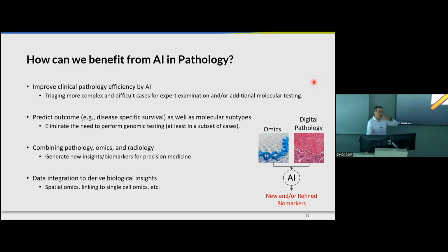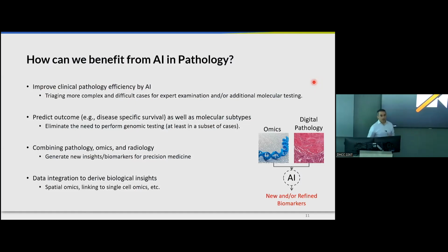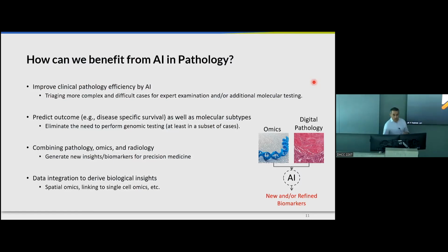And also, as an example, trying to identify molecular markers from histopathology images. So rather than trying to set up different molecular tests within the healthcare system, which is very difficult, costs money, and has a hard turnaround time, all that sort of stuff, if we can identify some of these markers from histopathology images, that would be fantastic. Because these slides get generated as part of the practice anyway. We just need a scanner to scan and run the algorithm. So that was the idea.